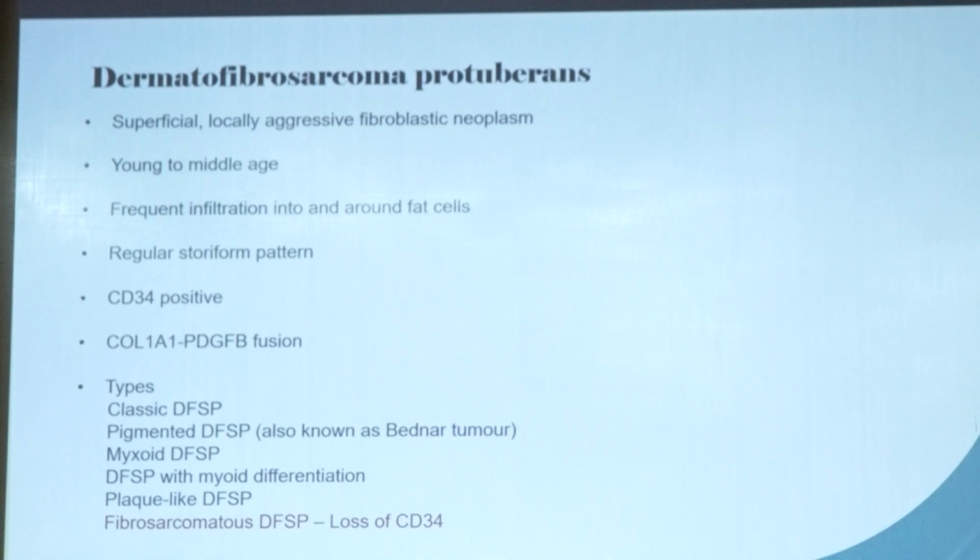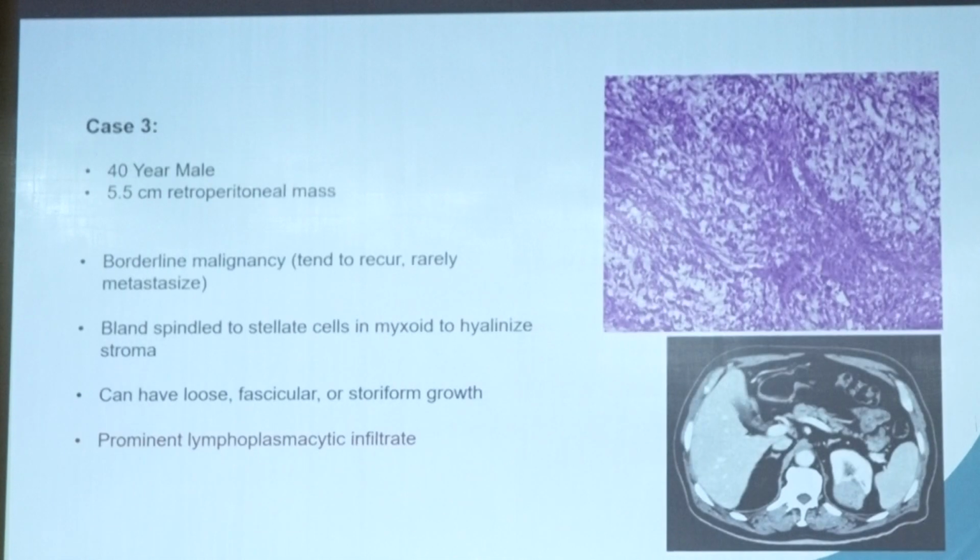Particularly when it is transforming into malignant, it will show even more mitotic index. So then we revisited, we looked at the mitosis, we also found the necrosis, and then we saw that that is the reason DFSP is transforming. That's why we are not finding CD34 here.